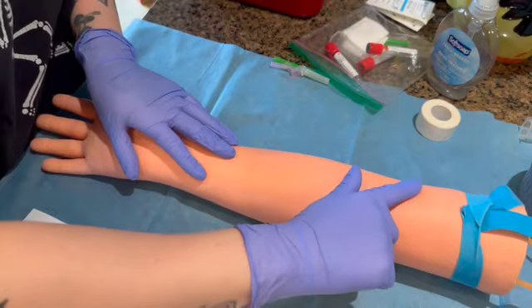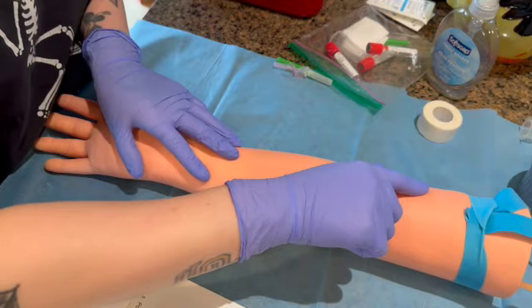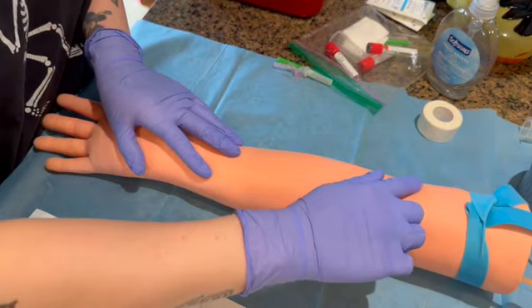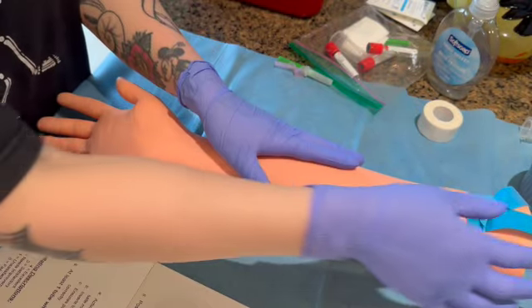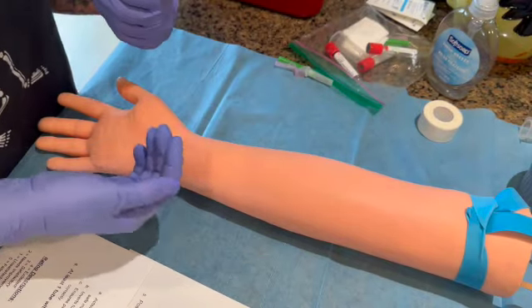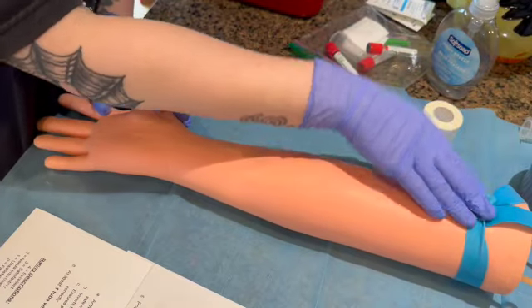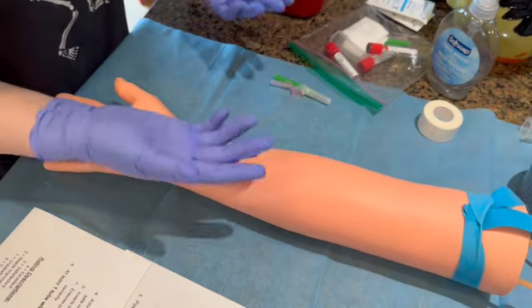If you're having trouble locating a vein, just stay calm and do what you need to do. So we're going to palpate for which vein that we want to go into today. And if you're in a situation where you've had it on for a long time, just do what we practice. Take the tourniquet off, prep everything else, and then tie your tourniquet when you're prepared to move on. We're just going to leave that on him for all intents and purposes. Make sure that you're following the rules of keeping it on no more than 60 seconds or 1 minute.